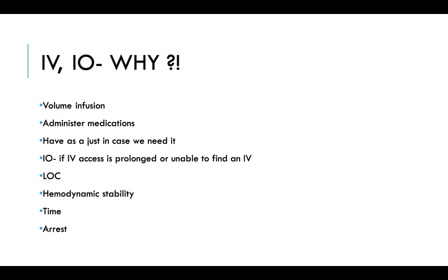IV-IO. Why do we perform this task? Volume infusion, I think, is number one. Administer medications. Have it as a just in case. The IO specifically, if IV access is prolonged or you're unable to find an IV site.